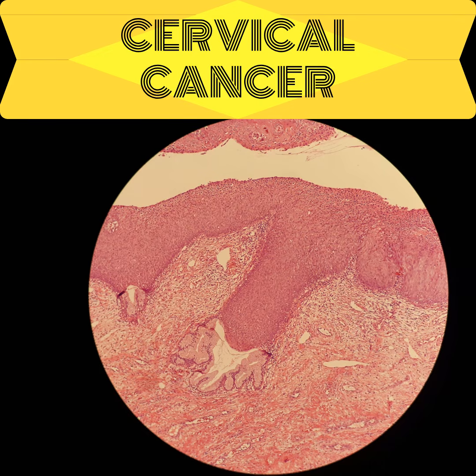This total thickness dysplasia represents the final pre-invasive stage before the basement membrane is breached to become a microinvasive carcinoma.